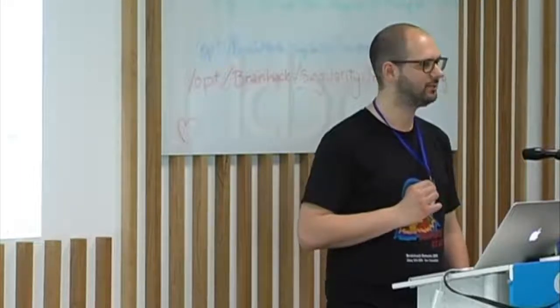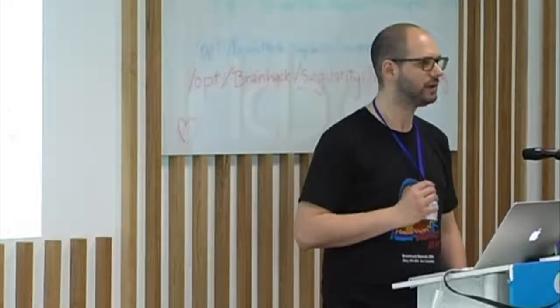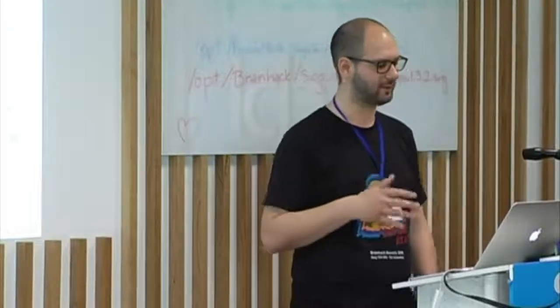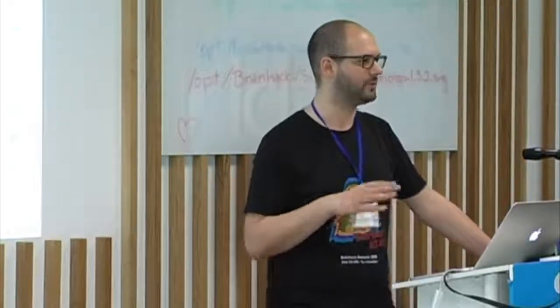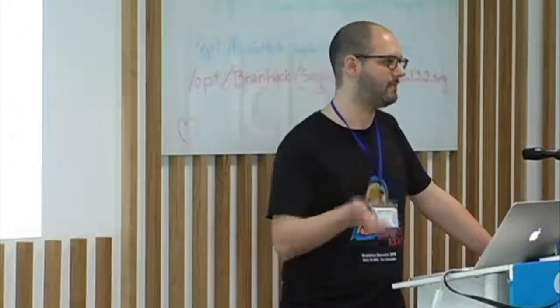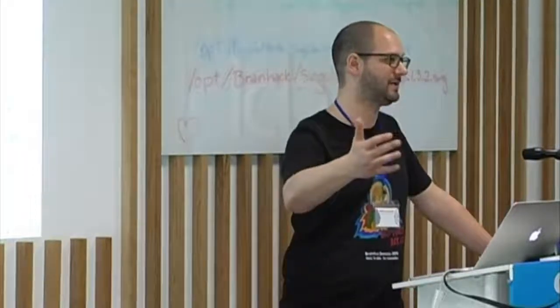I'm not sure whether it's in the release. I should double check that, but I know that it should be there, or at least we're planning to move those kinds of modeling into the new toolbox that we developed, called CUDIMOT, a microstructural modeling toolbox that allows you to come up with your own model and then just compile it and estimate it directly on the GPU in a very quick fashion. Because usually these approaches take a very long time, right?